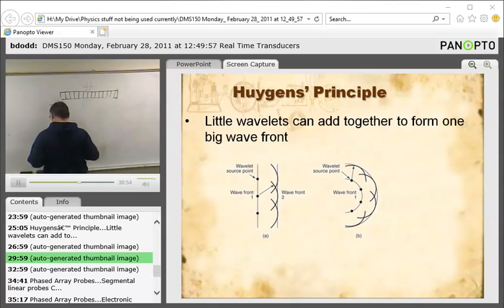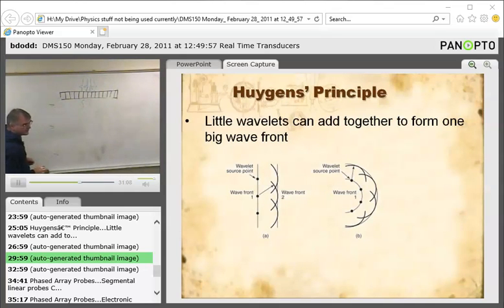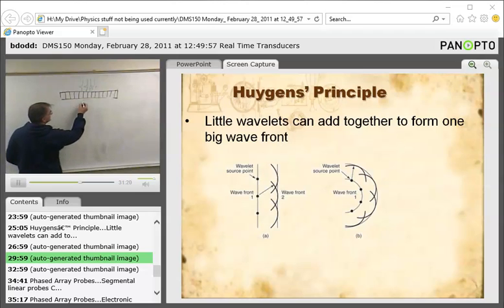So let's see. Do you fire them at the same time? I can. Is it usually done that way? Okay. It'll wait and listen for the near one, and then it'll strike them again. If we're doing this in one image, we'll fire off this one. It'll wait, and then once the sound dissipates, it'll send off another one now.